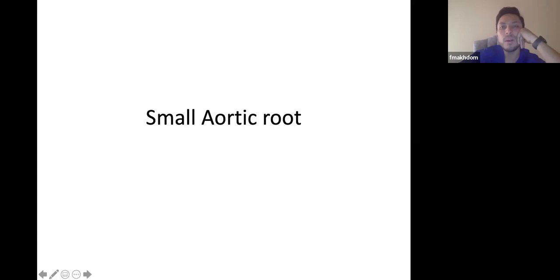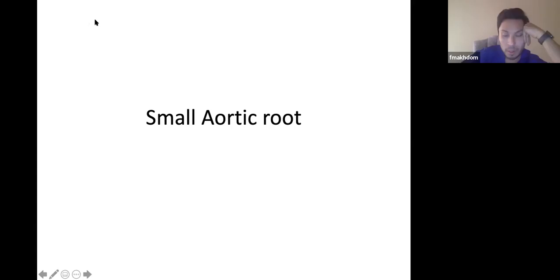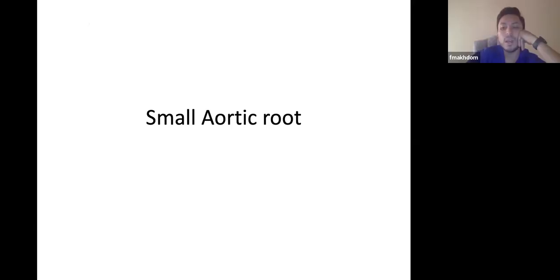patient. There's a chart that comes with each valve. It shows you which valve is suitable for the body surface area of the patient. So before you implant the valve, you have to know the chart. Usually it's available in the OR. If it's not available, you can look it up. It's available online. So before you go in, you know the body surface area of the patient.